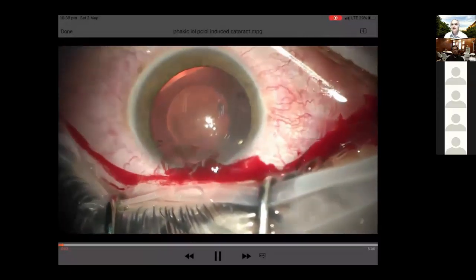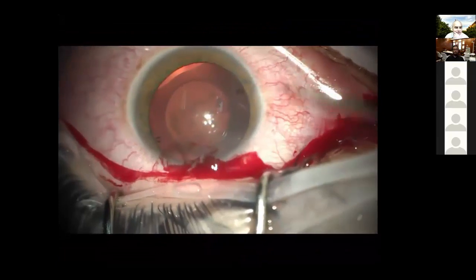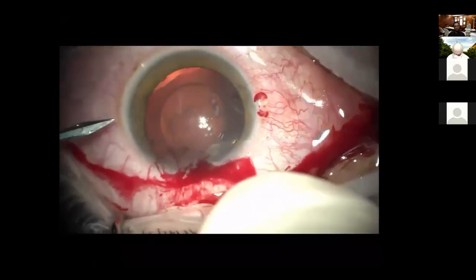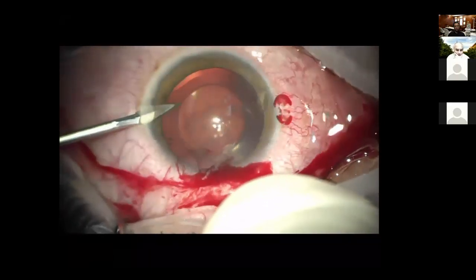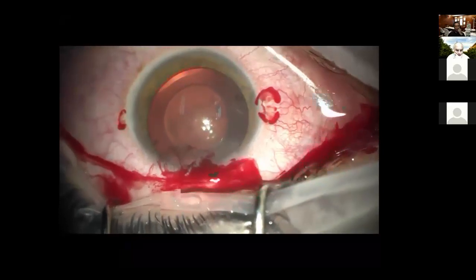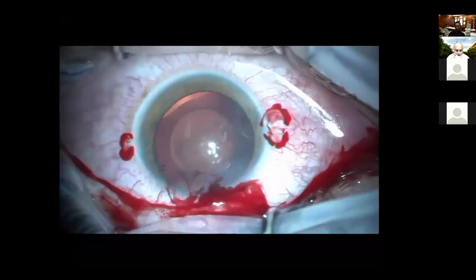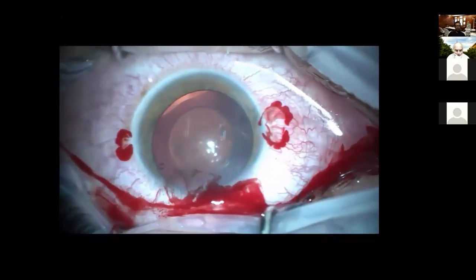Presenting a nice video with a patient who underwent phakic IOL implantation. It's not the typical ICL, it's an Indian-made type of ICL, but actually the result was that a cataract was induced in such a patient.